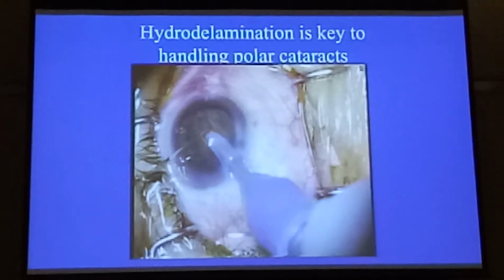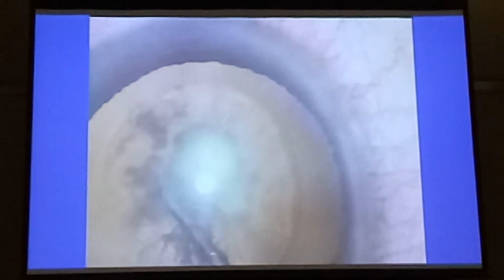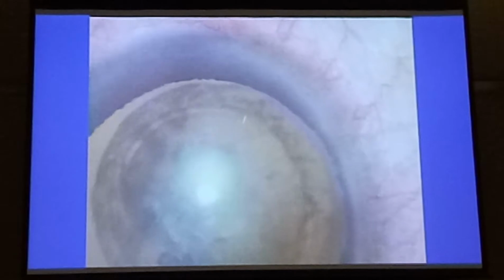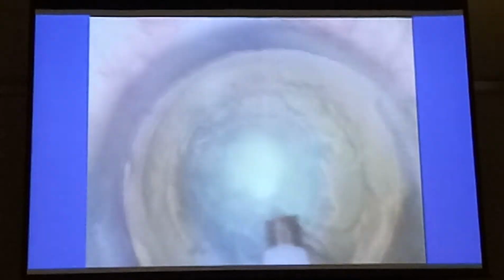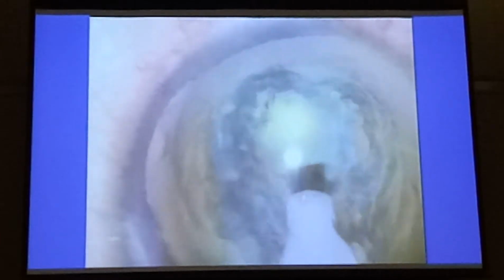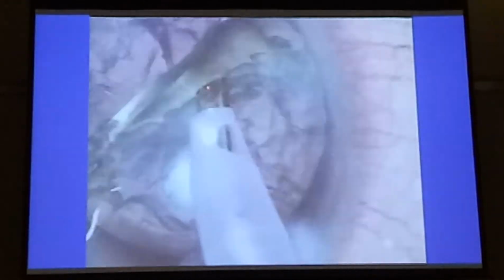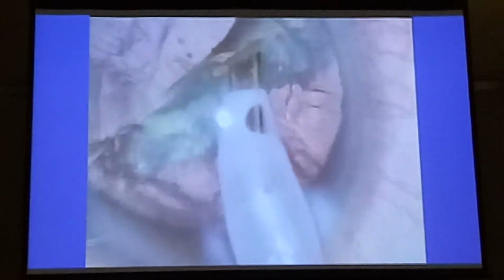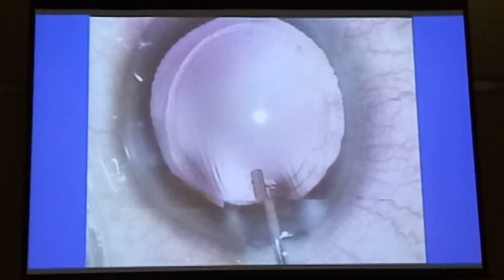Hydrodelamination is also key to handling posterior polar cataracts like this. You know that with these posterior polars, we do not hydrodissect, we hydrodelaminate around the nucleus, again trying to get that golden ring that tells me that I've isolated the nucleus, and then I'll go straight into memory 2, and then we will impale that nucleus again. Operation's over. Okay, your nucleus is gone, and then you can deal with the posterior polar opacity just by aspirating the epinucleus and pulling it away very gently from the eye. Again, hydrodelamination pays its dividends and you get a good outcome.